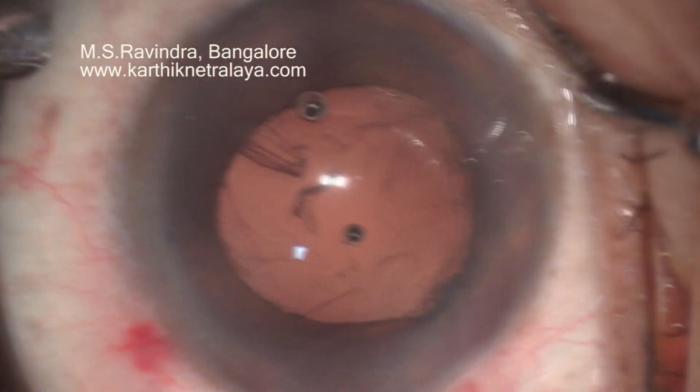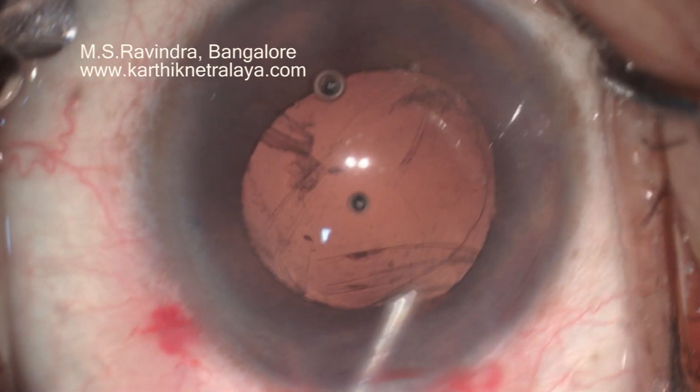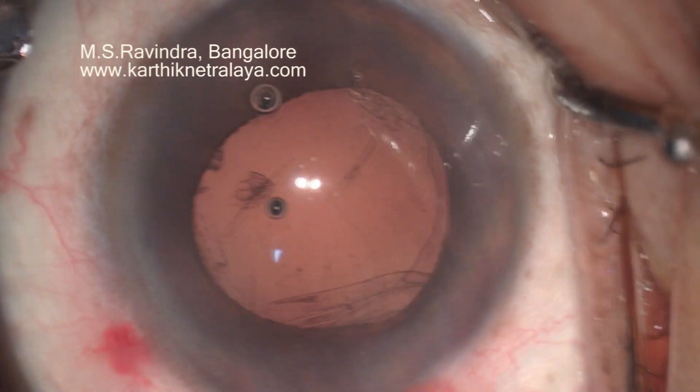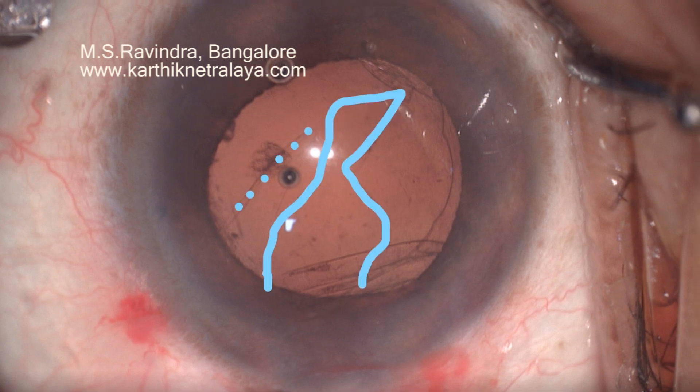The patient is nodding the head continuously and suddenly nodded the head at that point of time. You can see the tear starting from 1 o'clock position and going up to 6 o'clock, and the other end is at 7 o'clock.